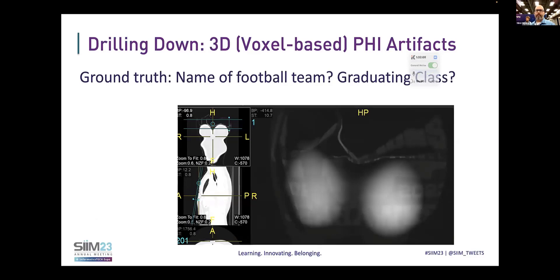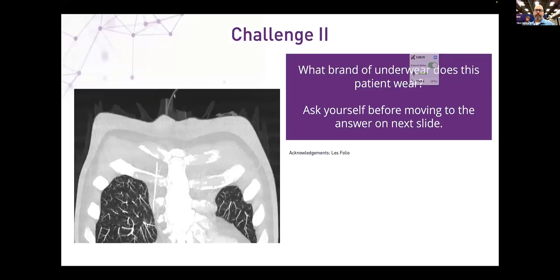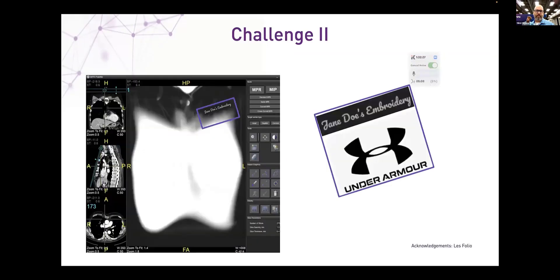Let's look at some of these three-dimensional artifacts. I'd ask the audience: what brand of underwear does this patient wear? Can you establish where this PHI vector is? Now we're localizing it, and reorienting the image — you can see quite clearly that we've got an Under Armour branded symbol. We've also embedded a synthetic artifact here, illustrative of other kinds of PHI that we might encounter, which would pose real serious re-identification risks.